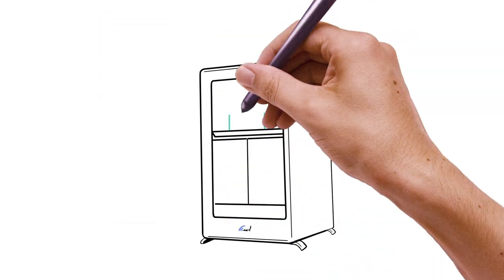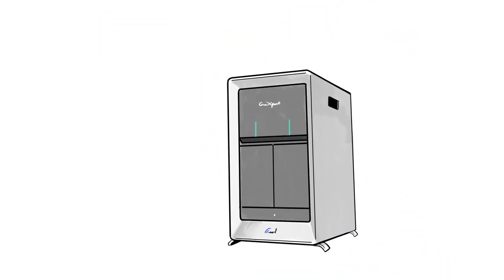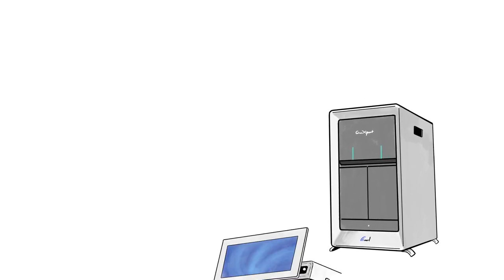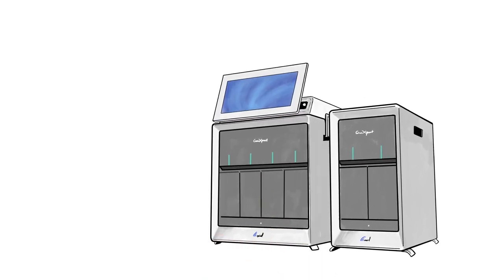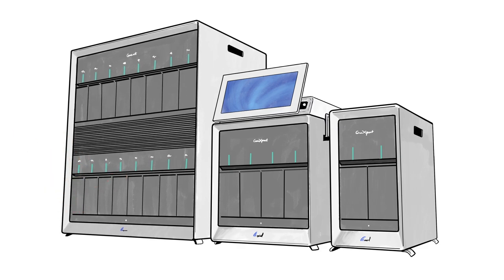The GeneXpert system is also scalable so regardless of your volume requirements, it can accommodate any workflow as your needs change. Simply select a box size and add modules as needed.